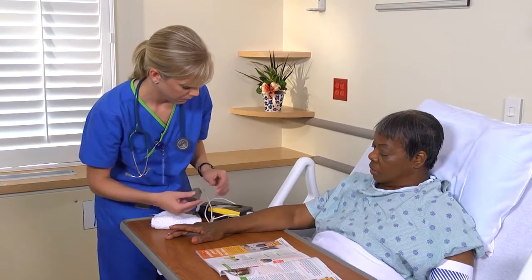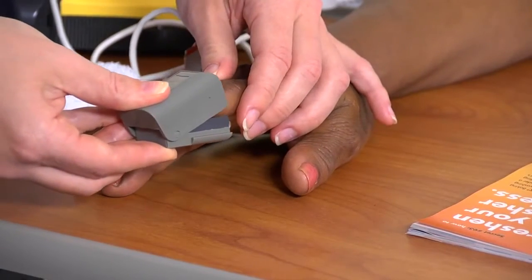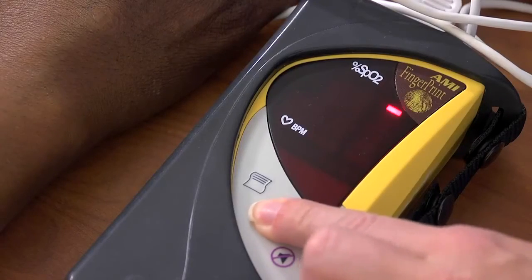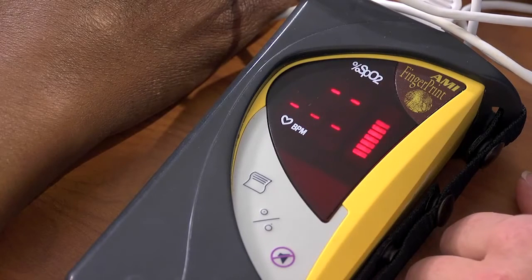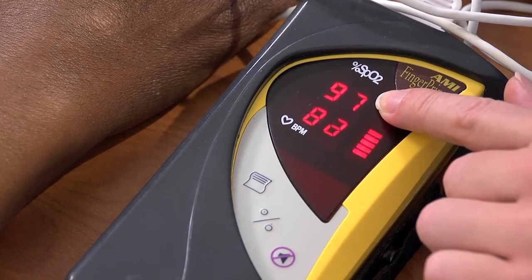Position the patient comfortably. If you're measuring pulse oximetry on her finger, instruct the patient to breathe normally. Then attach the sensor to the selected site, instructing the patient that the clip-on probe will feel like a clothespin on the finger but won't hurt. Turn on the oximeter. After you get a pulse waveform and intensity display and an audible beep, assess the patient's radial pulse and compare it with the oximeter pulse rate.